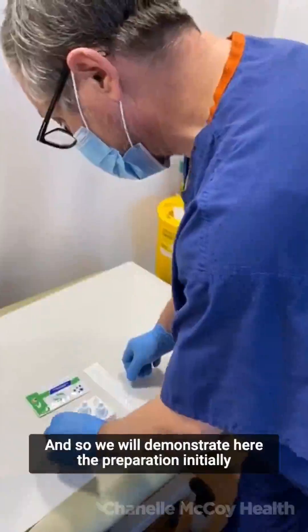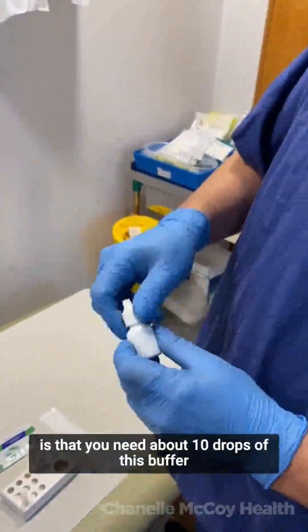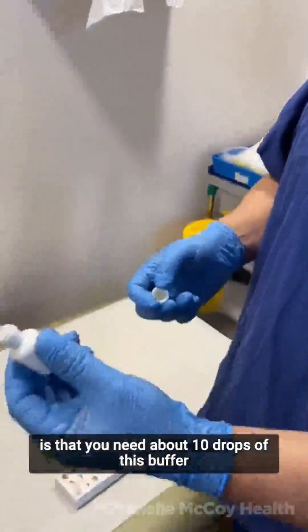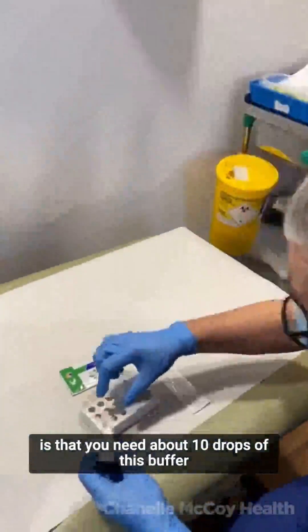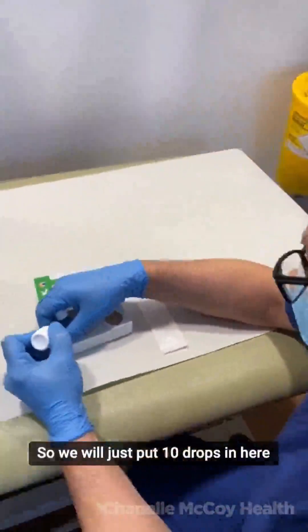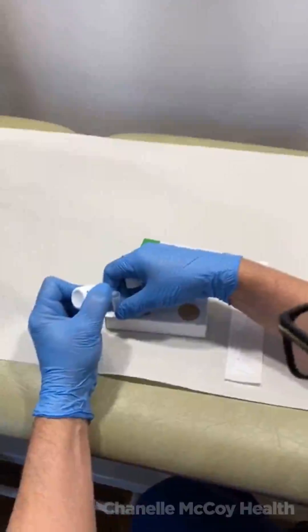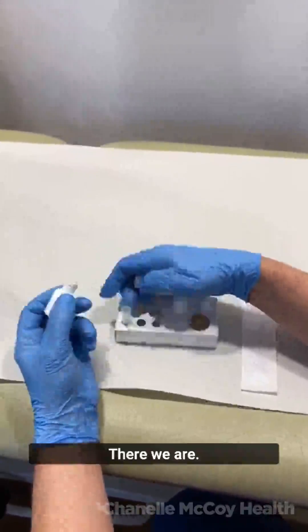We'll demonstrate here. The preparation initially is that you need about 10 drops of this buffer. So we'll just put 10 drops in here. There we are.